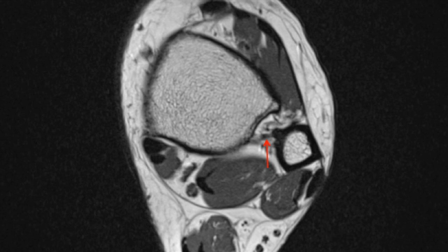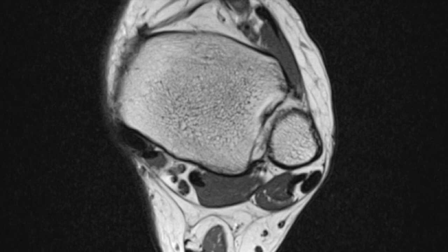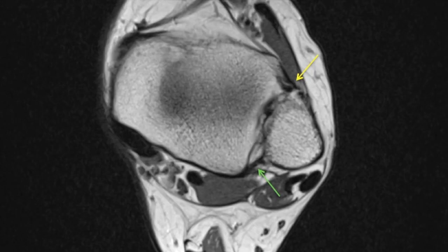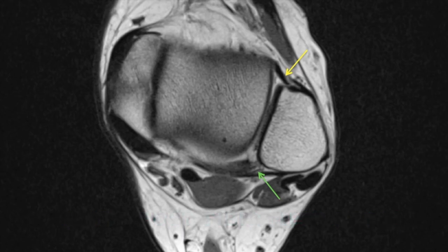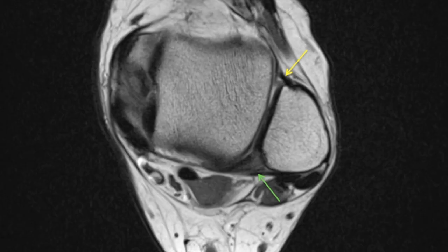Going further inferiorly, at the level where the tibia is ending and the talus is about to start, you can see thin hypointense bands both anteriorly and posteriorly bridging between the tibia and the fibula — these are the anterior and posterior tibio-fibular ligaments, which also run obliquely. The key to identify the level at which these ligaments are seen is when the talus has a squared appearance. These three ligaments — anterior and posterior tibio-fibular and syndesmotic — are high ankle ligaments, and injury to them can change management from conservative to surgical.